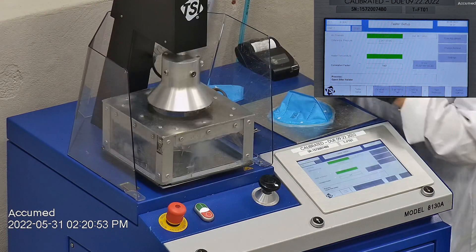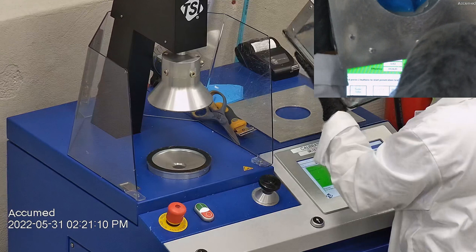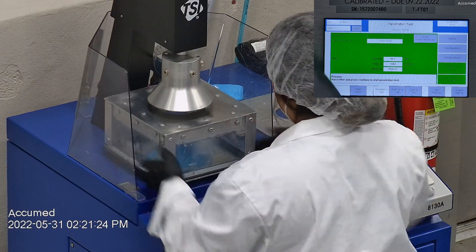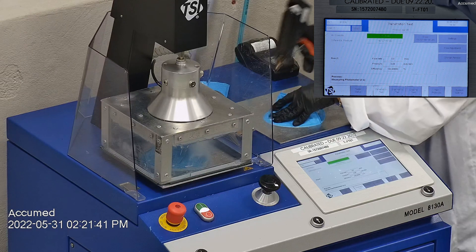The results are displayed on the TSI monitor. F stands for air flow rate, which we test at 85 liters per minute. R is for resistance, also referred to as pressure drop — this correlates with the breathability, so the lower the number, the more comfortable and breathable the mask is. E stands for filtration efficiency percentage.